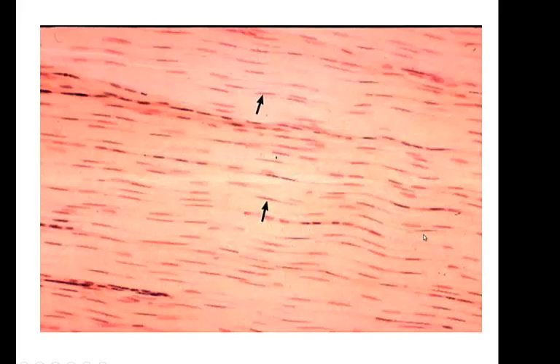Dense regular connective tissue. People mix this one up with smooth muscle. You're not going to mix this one up with smooth muscle, because write this down in your notes. I'm going to compare dense regular connective tissue with smooth muscle. The nuclei don't look anything like the nuclei for smooth muscle. In smooth muscle, the nuclei are bigger and oval, and they have lots of nucleoli. For dense regular, they're slit-like, and they line up in a row. So compare the nuclei of smooth muscle to the nuclei in dense regular connective tissue, and you won't have a problem. But do compare this slide to smooth muscle, because you'll mess them up if you don't.